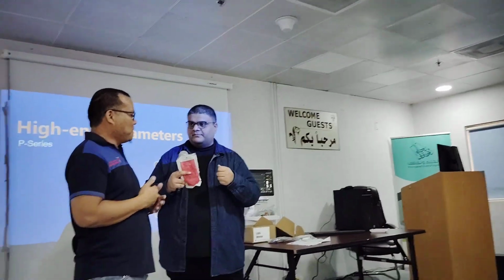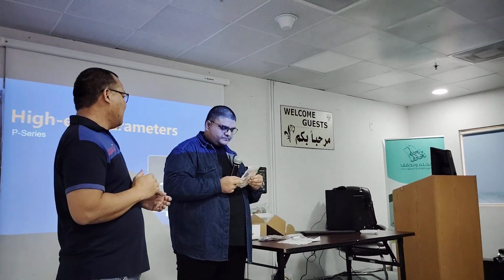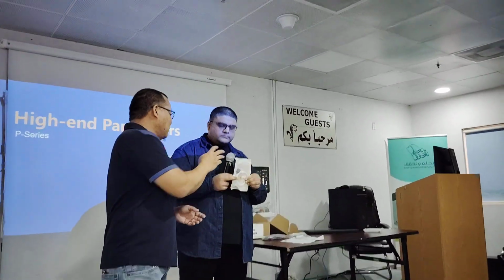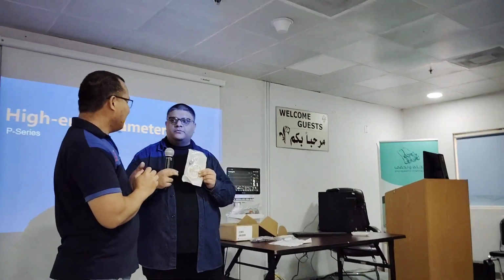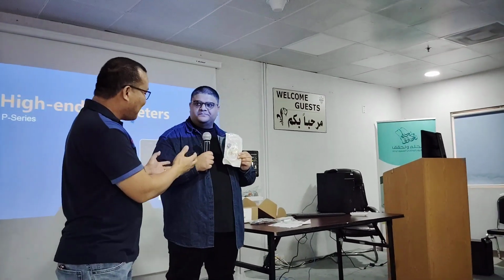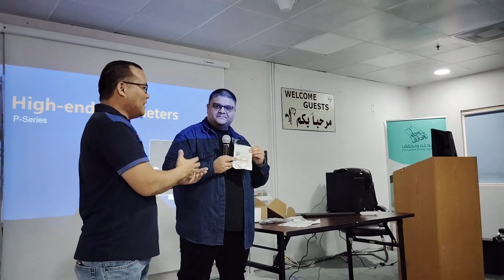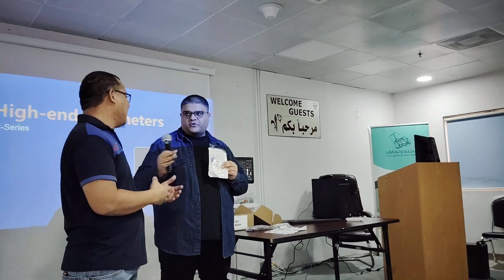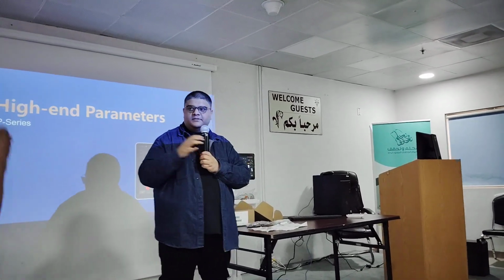It's like using an Android charger with your iPhone. That wouldn't work. Is it compatible or not? No, it should not be. Actually, the algorithm is different. Even if the cable is connected, it wouldn't work properly. Even the same company, your BioLite, but a different model like P series and Q series, it will not be the same probe. Correct. There is a dedicated probe for that type.